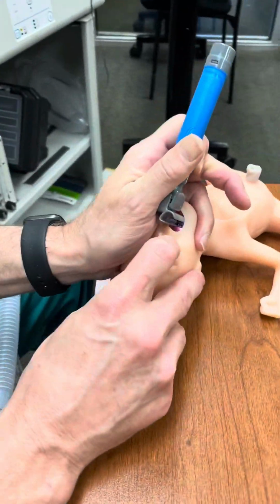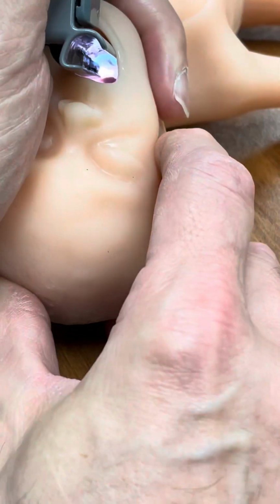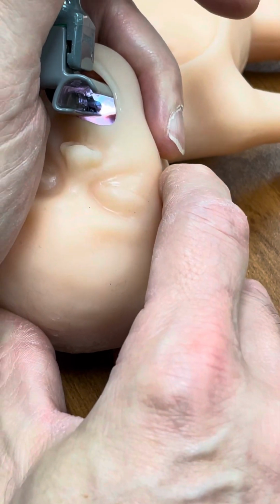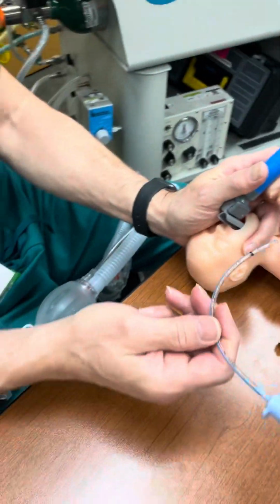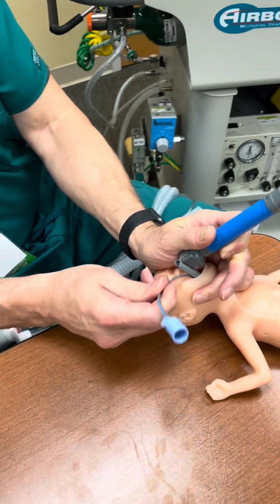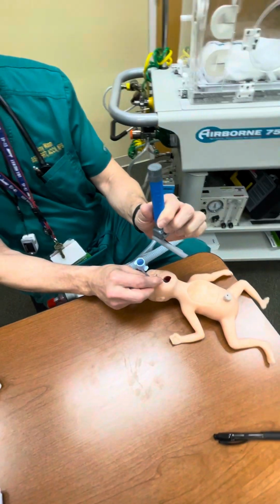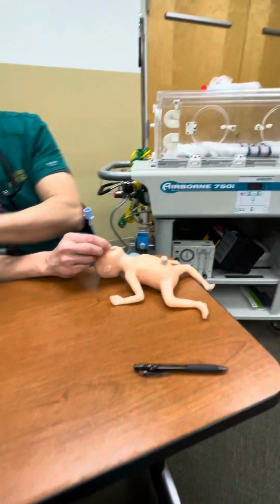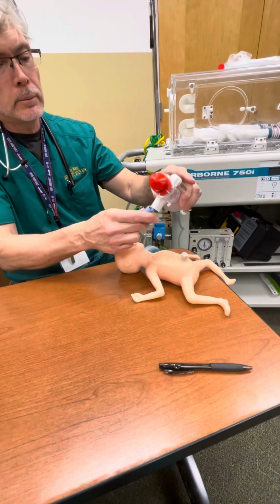Okay? If you want to take a look at the camera, you can probably see the vocal cords on the top. We'll drop a tube through there. Anyway, so when I'm going in with the ET tube, I'm going in from the side and I'm deflecting off the laryngoscope blade. Once you do it a few times, you're able to get the hang of it.